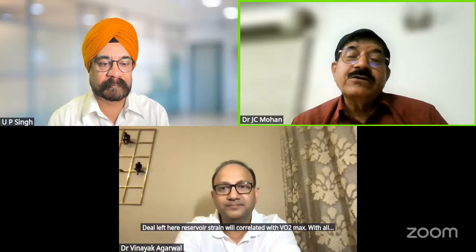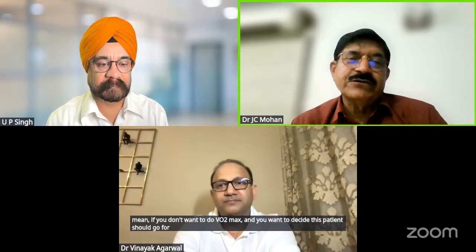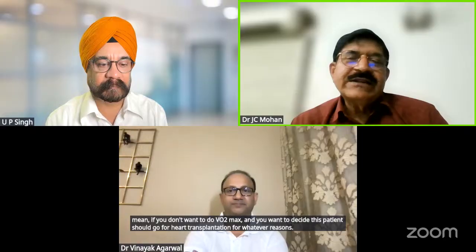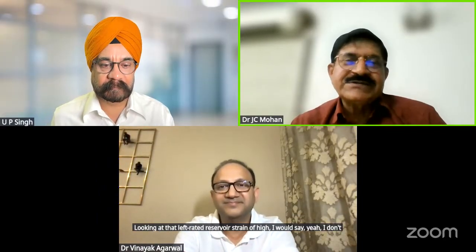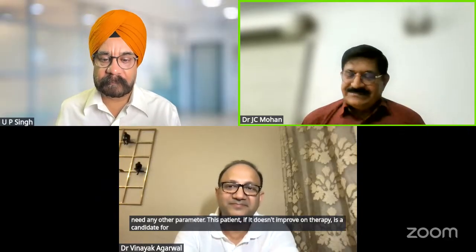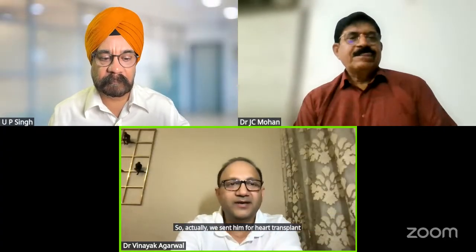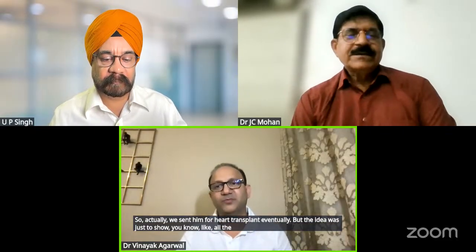The left atrial reservoir strain correlated with VO2 max. If you don't want to do VO2 max and you want to decide whether this patient should go for heart transplantation for whatever reasons, looking at that left atrial reservoir strain of 5, I would say, yeah, I don't need any other parameter. This patient, if he doesn't improve on therapy, is a candidate for heart transplantation. So actually, we sent him for heart transplant eventually. But the idea was just to show all the parameters in one patient. I think we were lucky to get that.